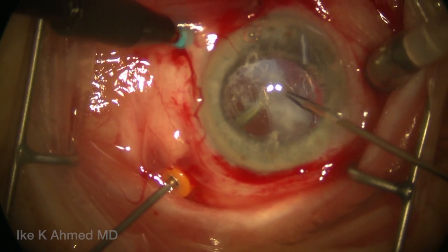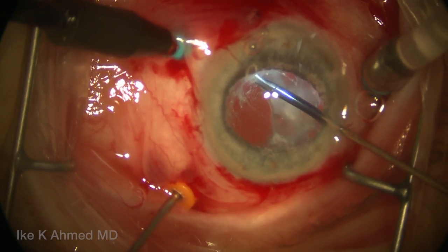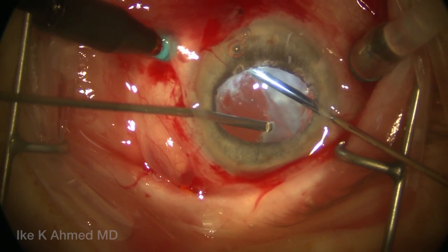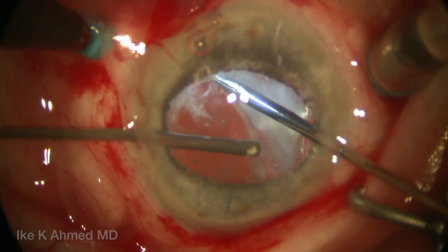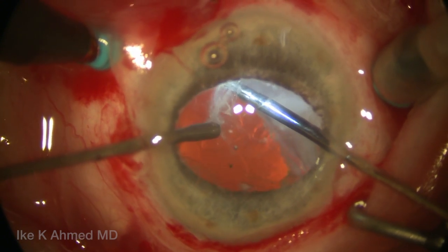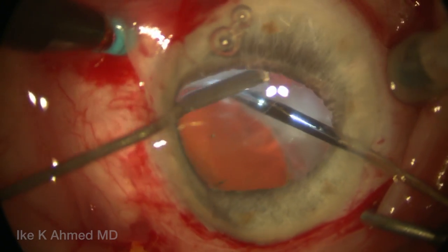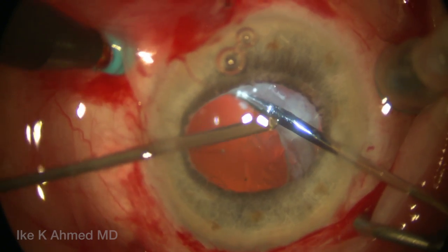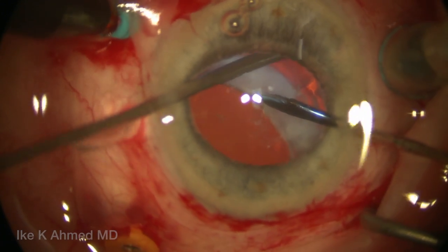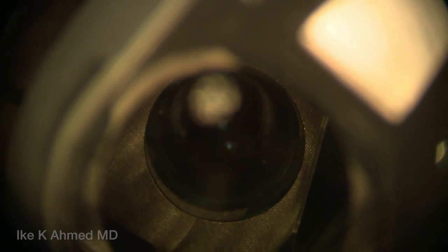We're going to do most of our work in the anterior vitreous. Notice that we're now using the micrograsper to hold the capsulorhexis to ensure we hold the IOL capsular bag complex. Placing the probe into the anterior chamber, we remove some of the anterior vitreous present anterior to the lens complex. The kenalog has highlighted the vitreous quite well. We want to ensure we remove sufficient vitreous anteriorly and around the entire IOL. The goal is to essentially remove a block of vitreous around the IOL, which is in the anterior vitreous compartment, in a limited vitrectomy fashion.